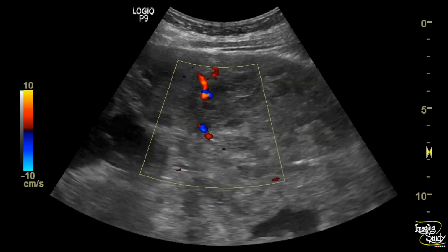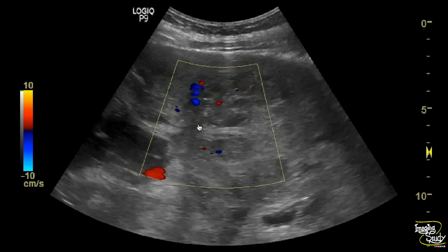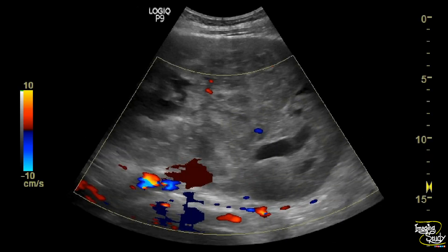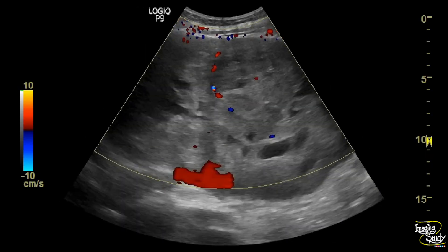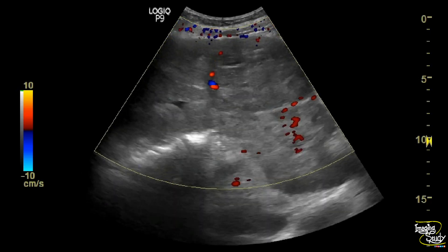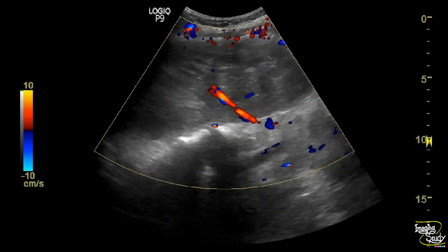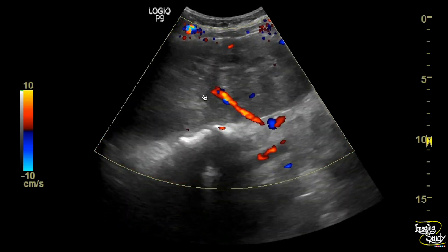On color Doppler, you can still see some vascularity within the parenchymal tissue. This is the main renal artery coming from the aorta supplying the kidney.